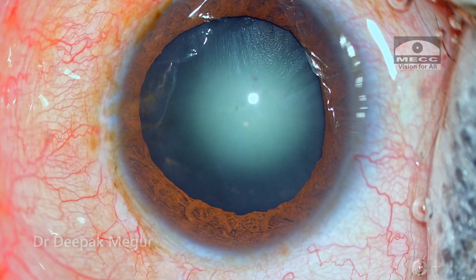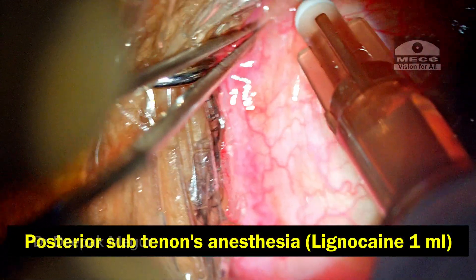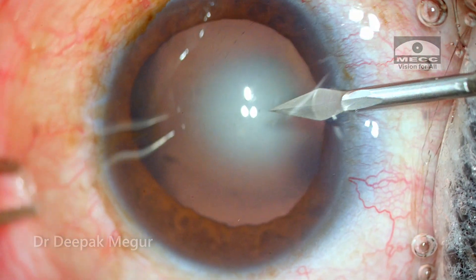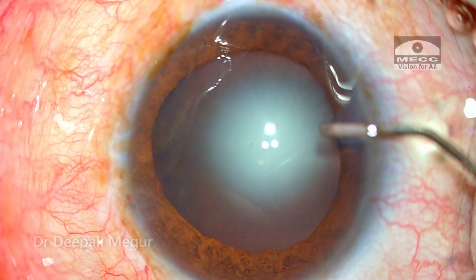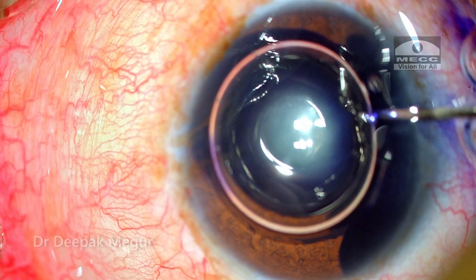The patient is very anxious so I'm giving an additional sub-Tenon's injection of 1 ml of lignocaine to enhance analgesia during surgery. He is also going to receive an intracameral dose of preservative-free lignocaine as the side ports are being created and the capsule is being stained.